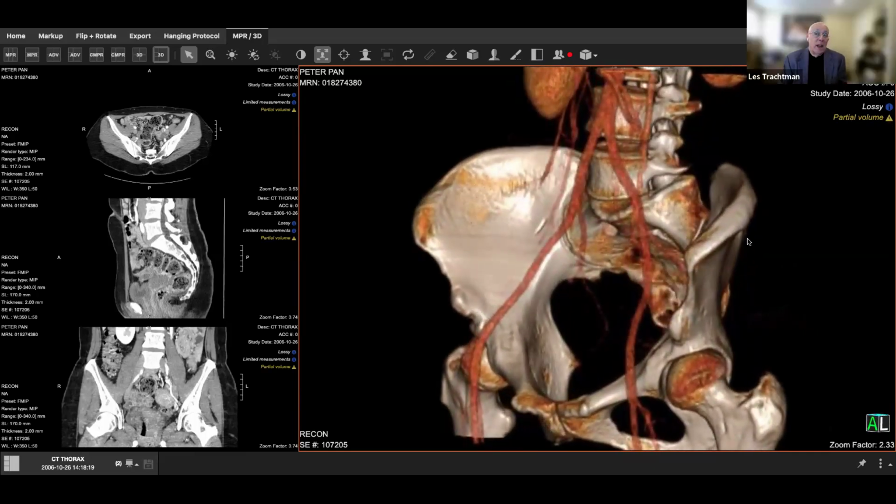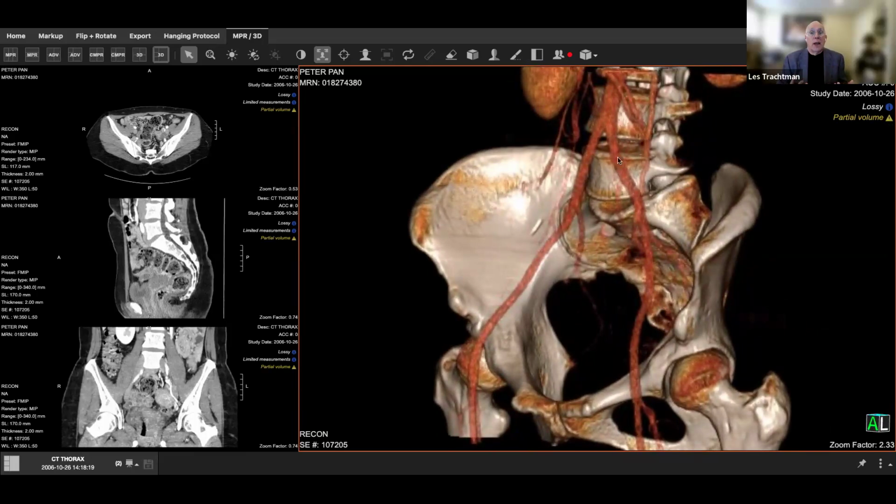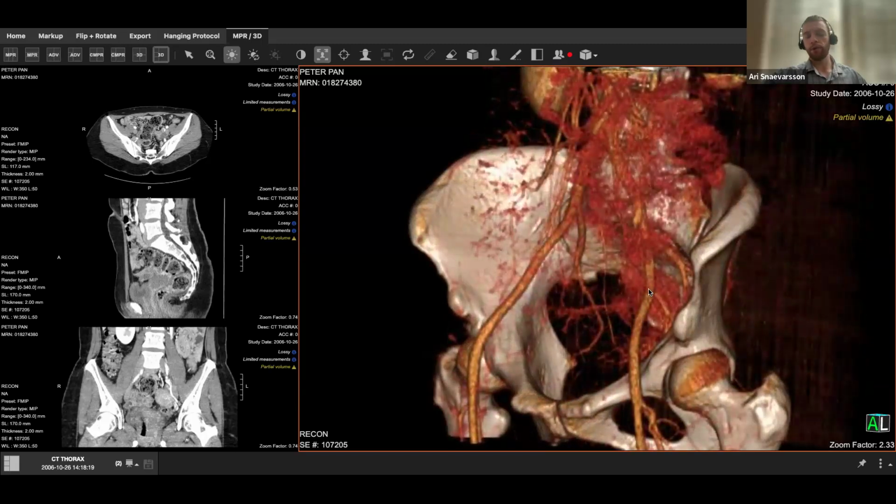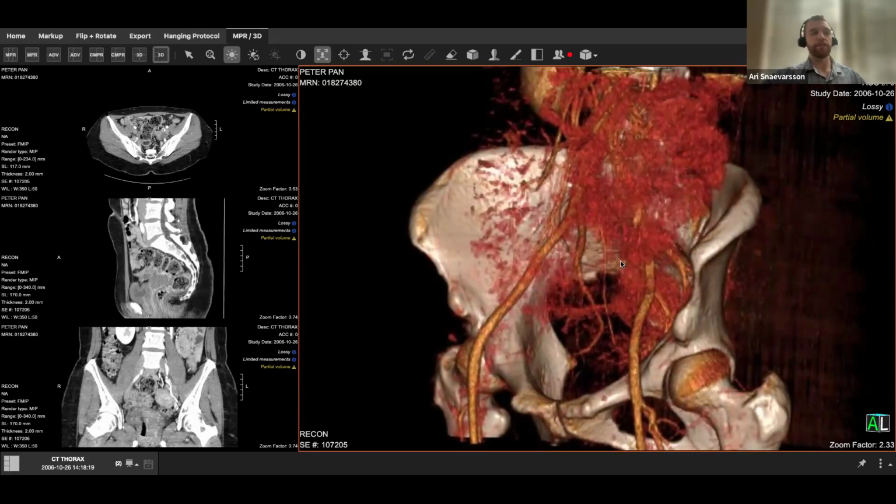That's just, I mean, as a lawyer looking at a medical image and realizing that I'm going to have to show somebody in a courtroom what actually happened or what should have happened, this is gold. This is magic. Yeah, you talked about a picture being worth 1,000 words and DICOM maybe being worth 1,000 pictures or more, and this is worth quite a few when you're in front of a judge and jury. Now we have something significantly deeper than just a general animation or explanation of an injury. We can look at exactly where this has occurred and get a more visceral view.